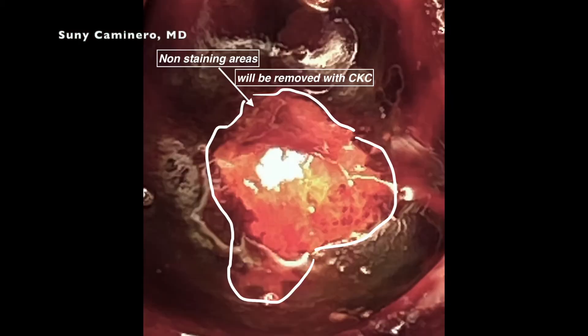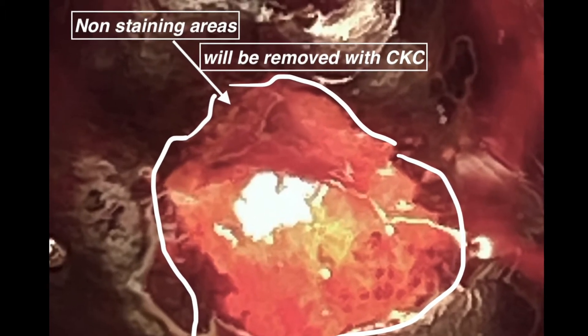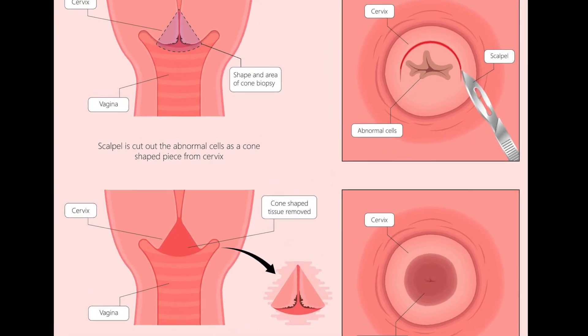There you see the non-staining portion, and that is the portion that's going to be removed and sent to the pathologist to read under the microscope to see if there are any cancer cells.